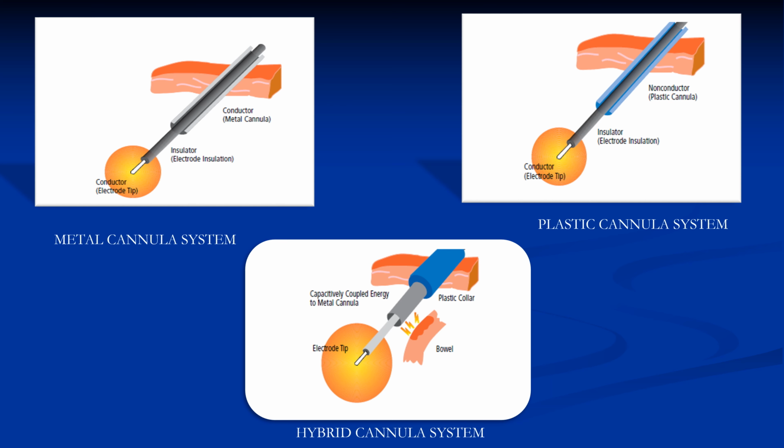Capacitive coupling during endoscopy. As we see on the upper left side of the screen, the metal cannula system. I need only to mention the definition of a capacitor. Capacitor means current occurs whenever a non-conductor separates two conductors.